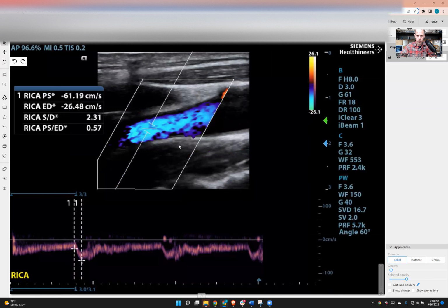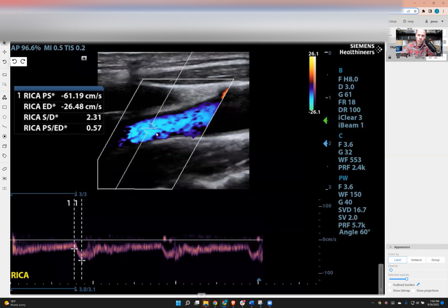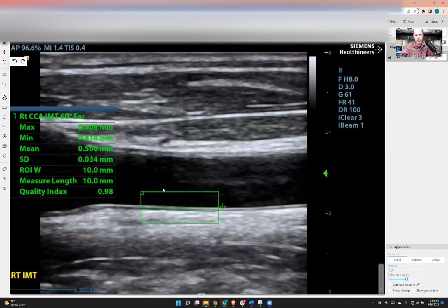So red is going up to the brain, or blue is going up. This red is a little bit of retrograde, a little bit of backwards motion. And it's no coincidence that the irritation in the lining and the backwards motion flow of the artery is very important. So again, we measure how fast it is. My blood speeds are fine.